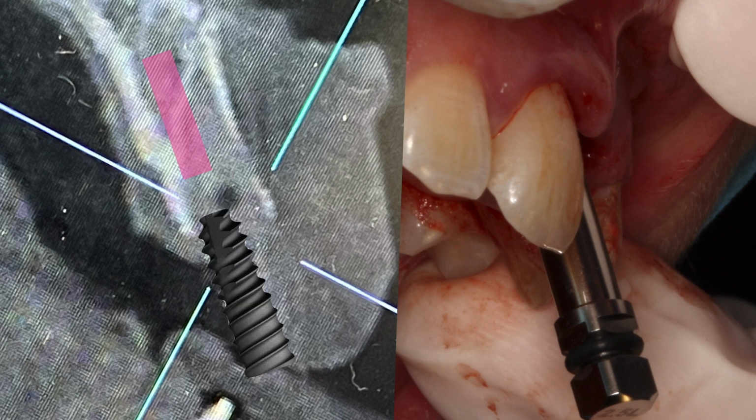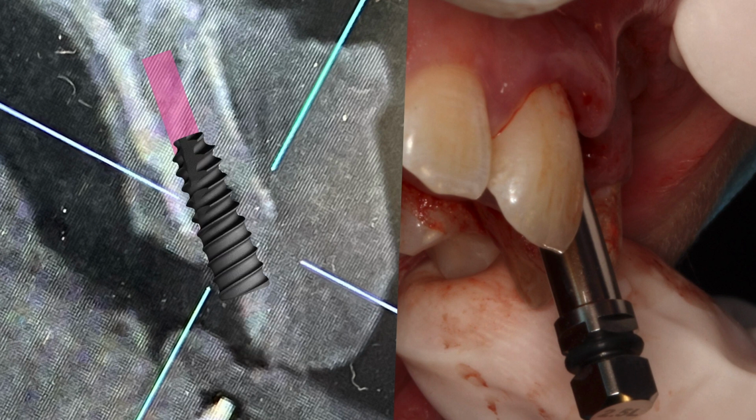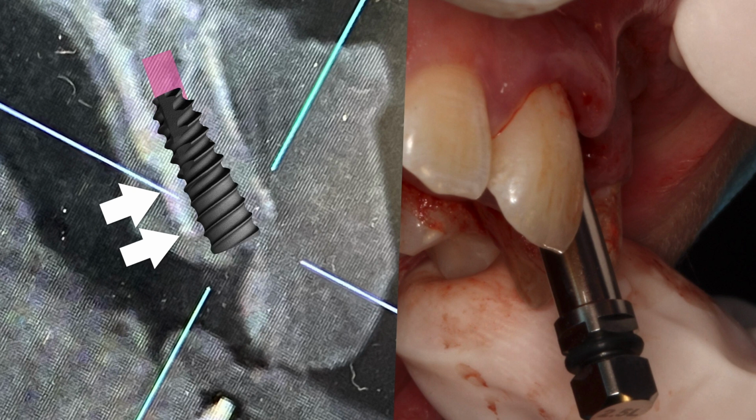And then once the implant is going into that trajectory, what tends to happen is it tends to go in fine initially, but as the implant goes in more apically, it starts to hit the palatal bone. And the palatal bone is dense, and therefore it will provide some resistance and actually end up twisting the implant so that the implant changes direction and trajectory.